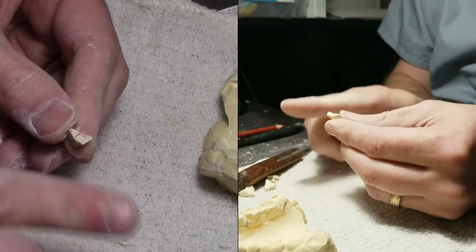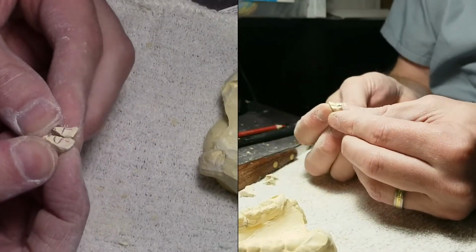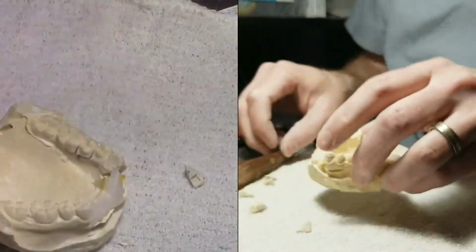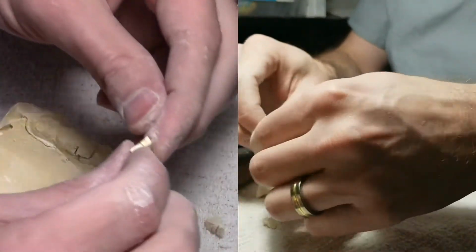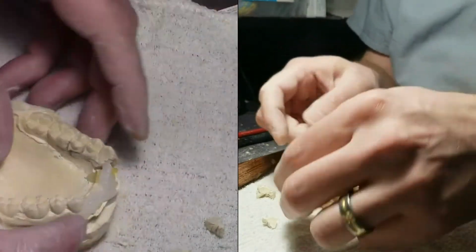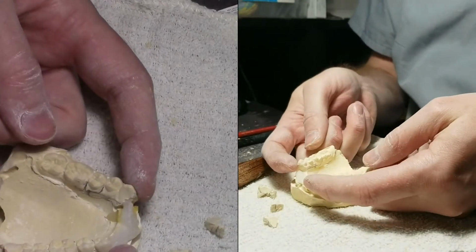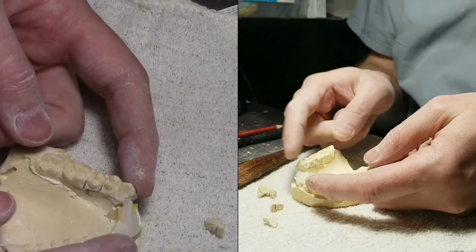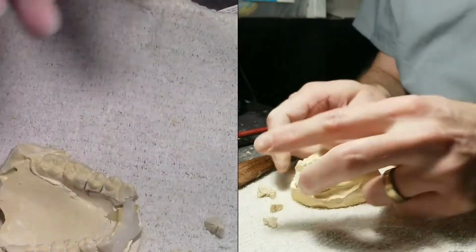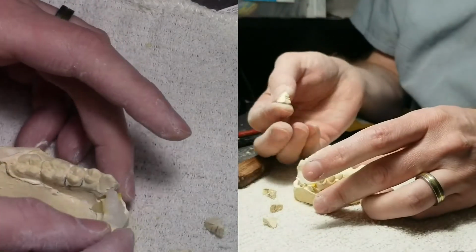And that helps them to slide past one another. So whenever I'm resetting them, they'll be able to slide past one another. Alright, so the fun part. I usually start on the two ends. And again, this is a little bit different because I'm adding this canine into the reset mix. I don't usually like resetting canines. They're just so hard to reset or to get them to move. So I'm going to start with that one.